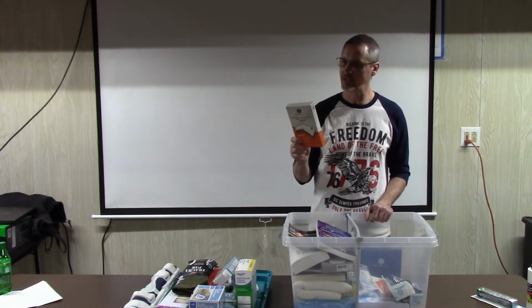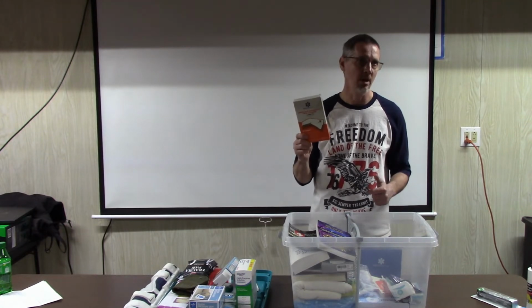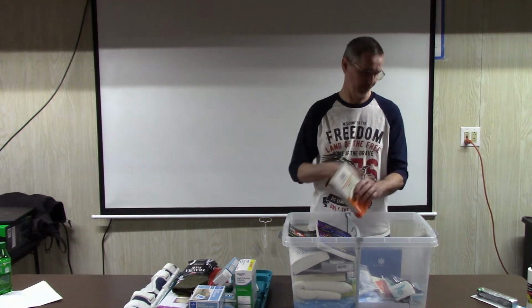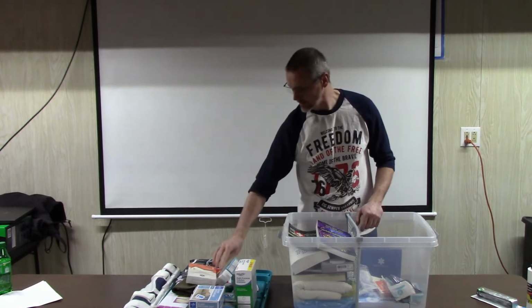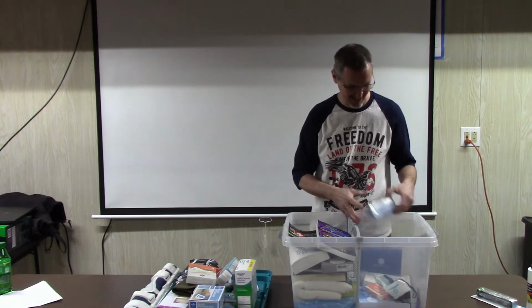Disposable stapler, it's a skin stapler. These come with the stapler, staples, and the staple remover. So if you've got a cut, you can just zip down it with the staples instead of doing sutures. Who's volunteering at the end of the class? Okay, Chris. Why are you looking at me?